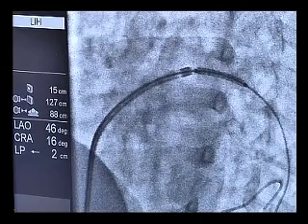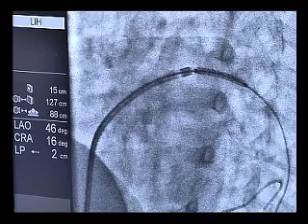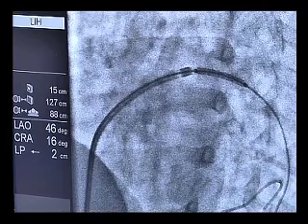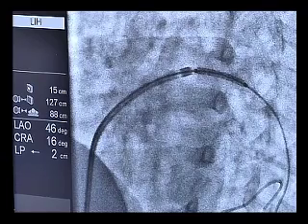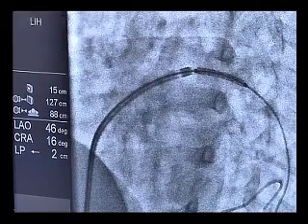We will put a 9 millimeter balloon just to see if the dilation is enough. Then we will increase, if it's necessary, up to the desired diameter. We use this kind of stent in order to put the smallest possible long sheath, because it's very difficult to cross the tortuous stenosis with a larger long sheath. Now we will check another time.